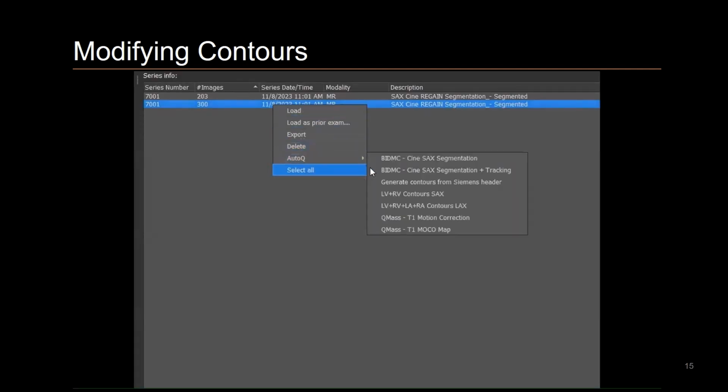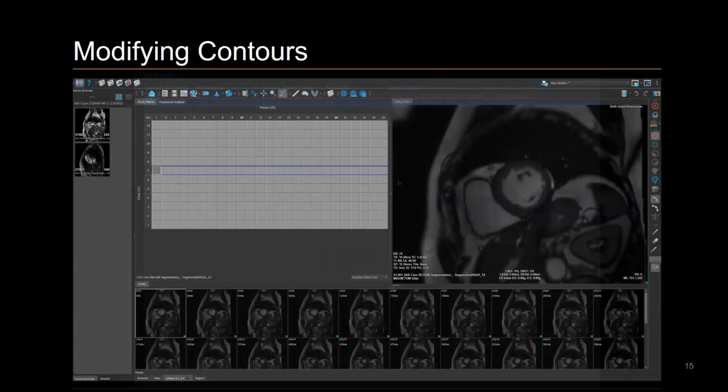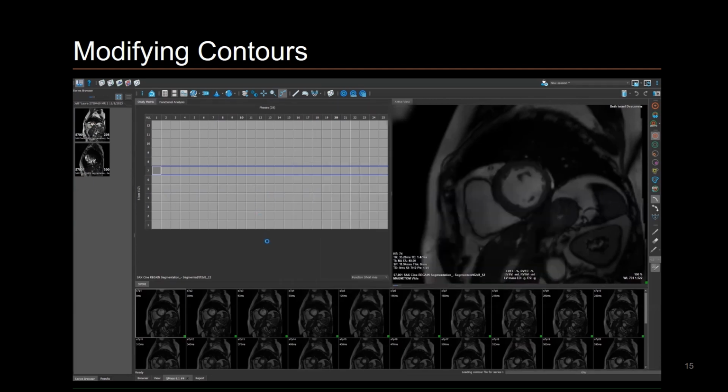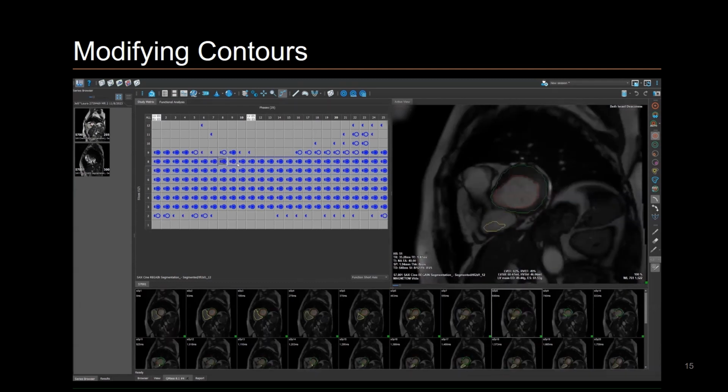We demonstrated the ability to manually adjust these contours by transferring the images from the scanner to Medis, a cardiac image software suite, where a custom add-on allowed us to extract the ML-generated contours from the DICOM header and create a Medis-compatible contour file. The users can then load the generated contour file, which will allow us to review the ML-generated contours within the Medis cardiac imaging software. Users can then make manual adjustments to the contours as needed, allowing for quality control for the automated ML-generated contours.